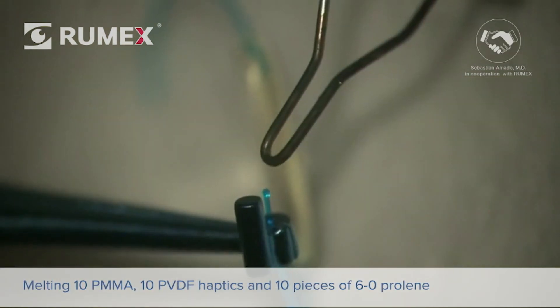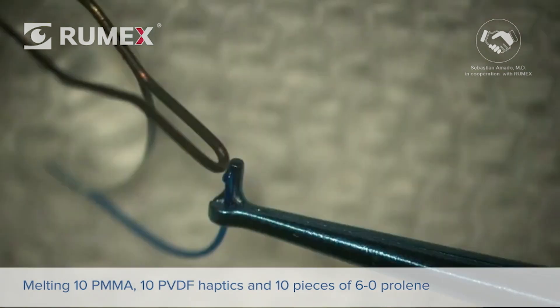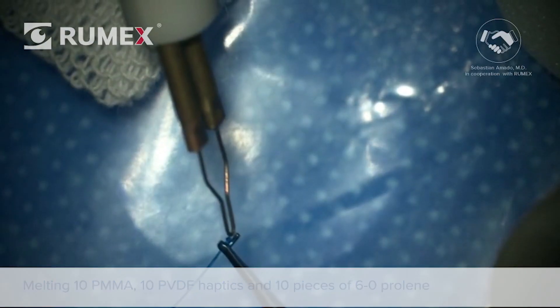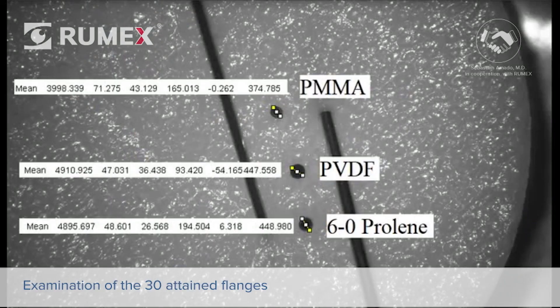We then proceeded with the melting of 10 PMMA haptics, 10 PVDF haptics, and finally 10 pieces of 6-0 prolene as well. These 30 flanges were measured through the acquisition of several high-definition black-and-white photographs, in order to better define each structure. From a top view, we found for the PMMA haptics group, the mean flange diameter was 374 microns.